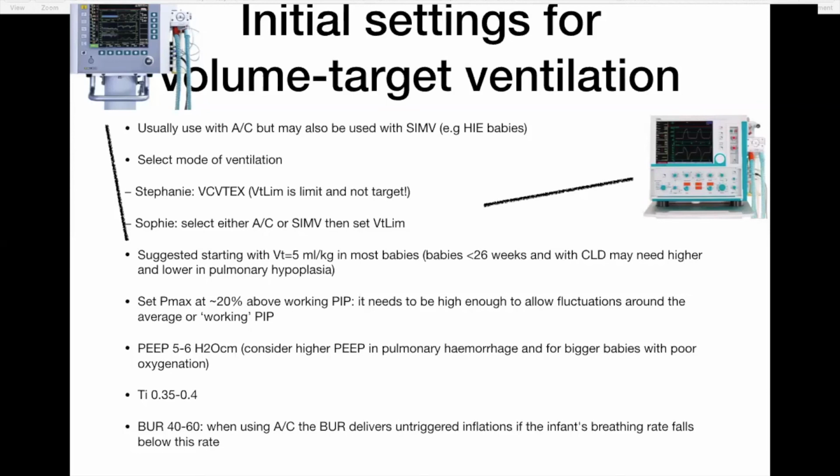So this is what our guideline tells us about how to set a ventilator initially when you have a new admission to the unit.